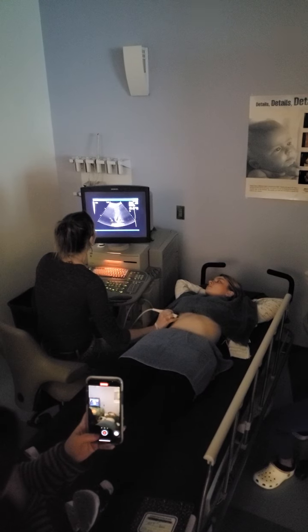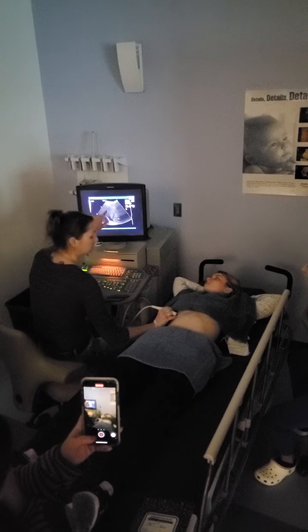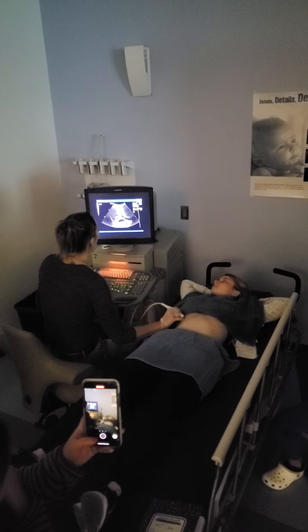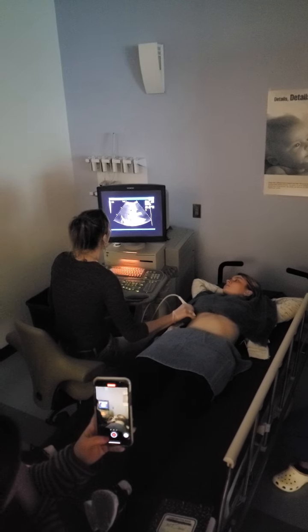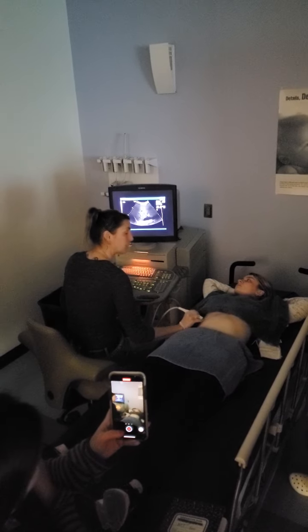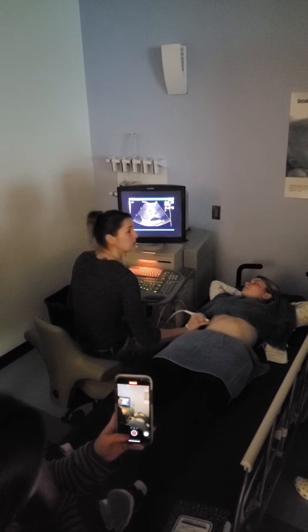So here we are angled up, all the way up towards the dome, we've got a little bit of lung. We're angling way up, coming into hepatic land, angling down into portal land. And if I continue my angle, then I'm going to get into kidney land. So this is all one rib space. Some patients, you may have to move a rib space to get from one neighborhood to the other.